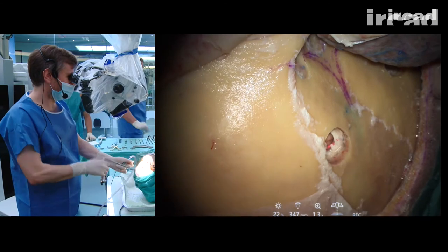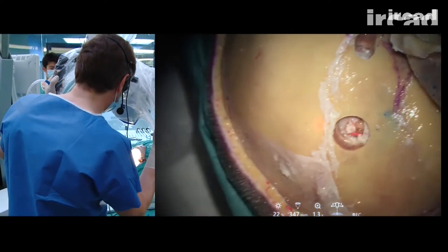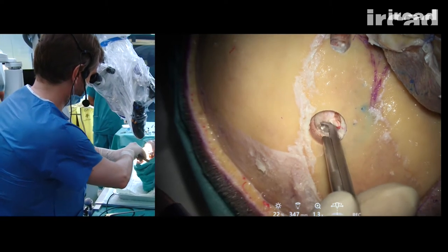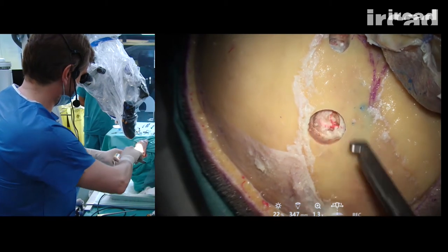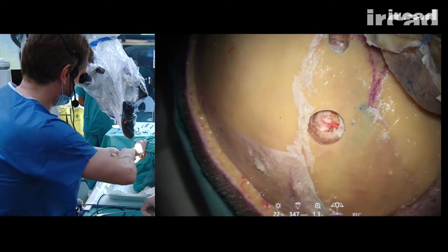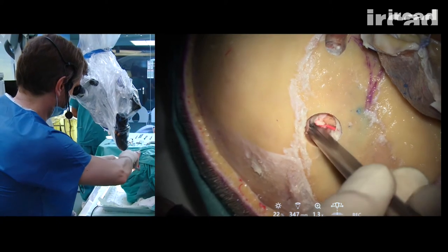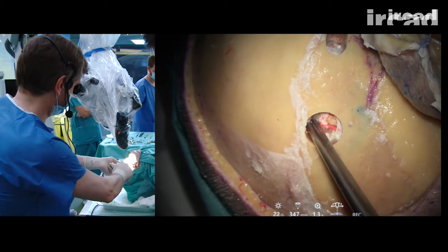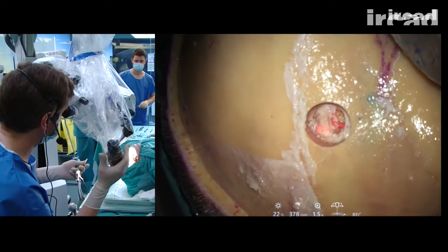Now we have to elevate the dura from the inner cortical bone. It's not necessarily very easy in this case because I have the feeling that the dura is extremely thin and fragile, which happens quite frequently with age. It's important to preserve the dura mater intact, especially for extradural approach.